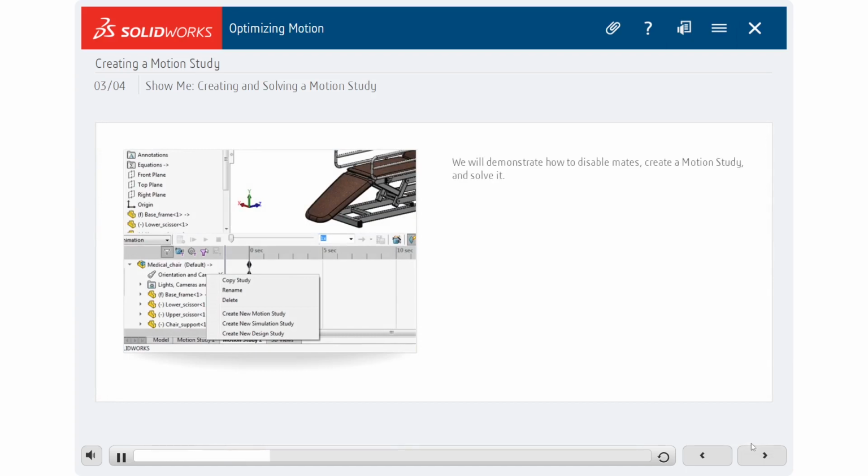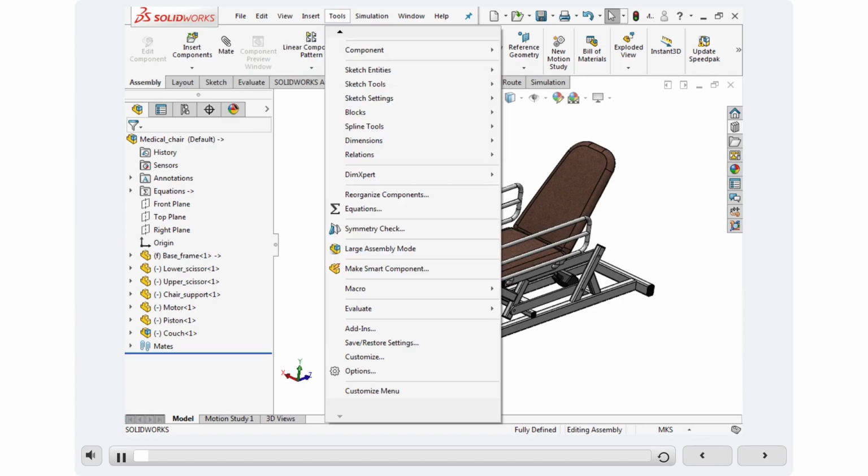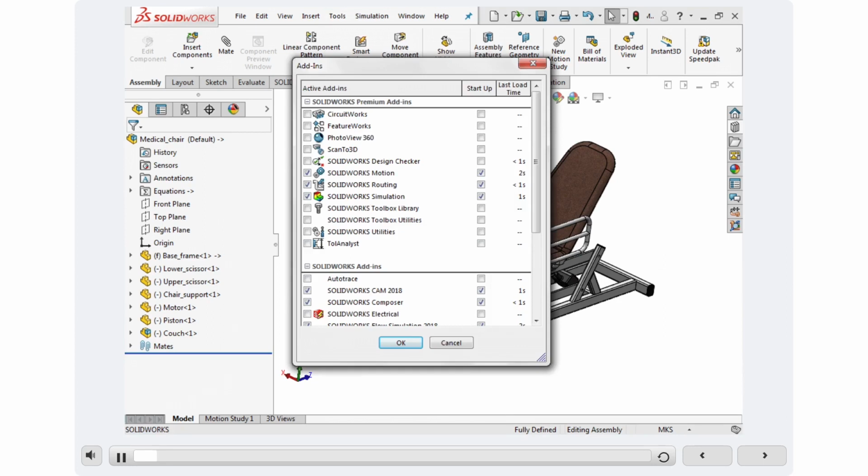Let's see how to disable mates, create a motion study, and solve it. Click Show Me to launch a demonstration video. The assembly file medical chair has been opened. Click Tools and click Add-ins. Make sure that the add-ins for motion and simulation are checked. Click OK.